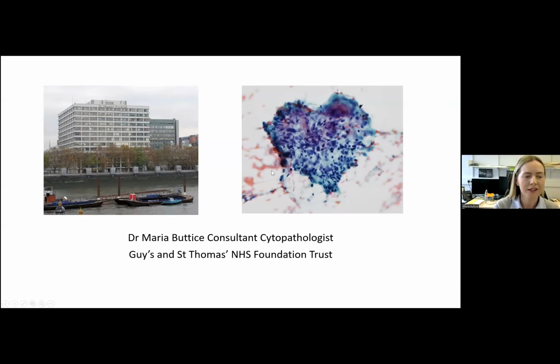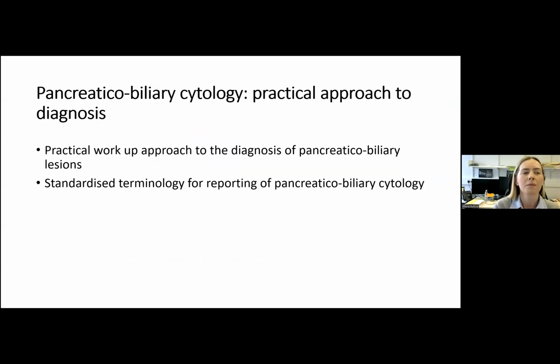So thank you all. It's a great privilege to have been invited to the BAC tutorial. My name is Dr. Maria Buttice, and I'm a consultant cytopathologist at Guy's and St Thomas's. My topic today is pancreatobiliary cytology, and this is one of the fields that is quite challenging to cytopathologists, in that we are often required to make precise diagnoses, and often it is the only modality by which pancreatobiliary lesions are sampled.